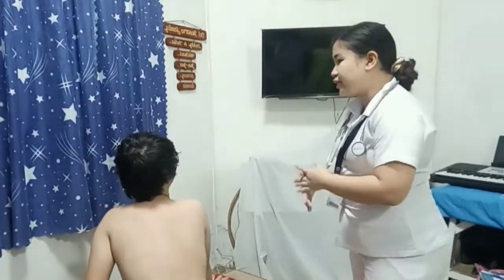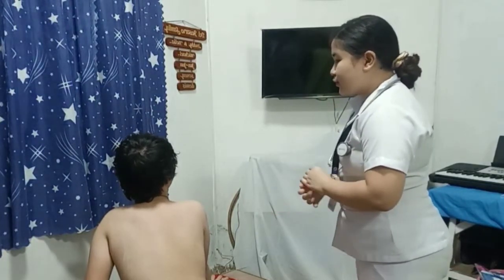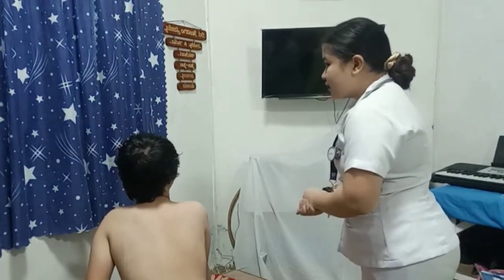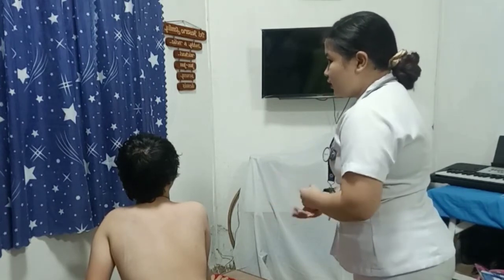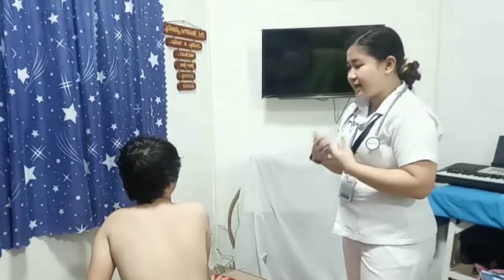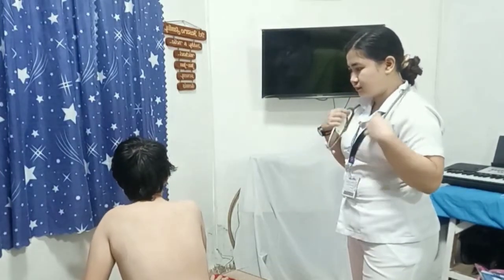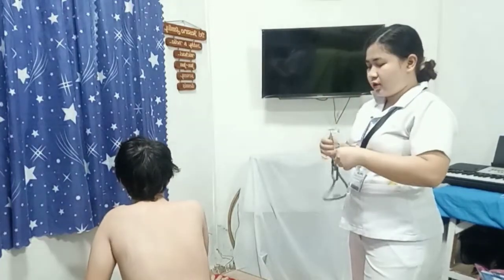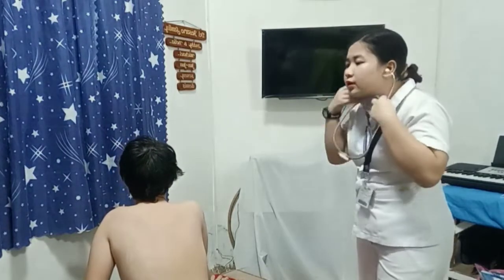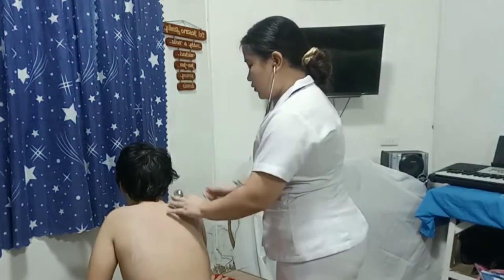Okay, so I can hear some adventitious sound upon auscultating your posterior thorax. So may I ask you to cough, since coughing may clear the lungs, and then I am going to auscultate it again to ensure if the sound that I heard is adventitious, okay? Okay, can you please cough? Okay, so I am going to listen again, okay? So inhale, exhale.